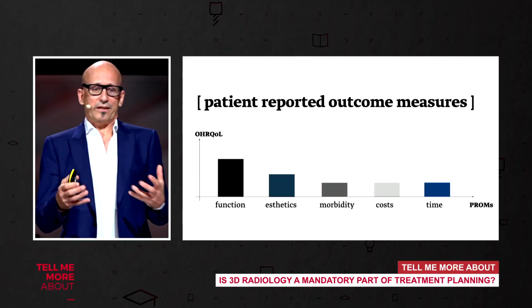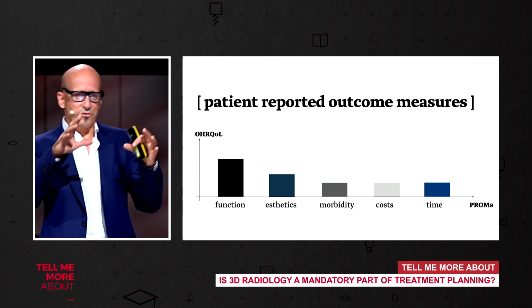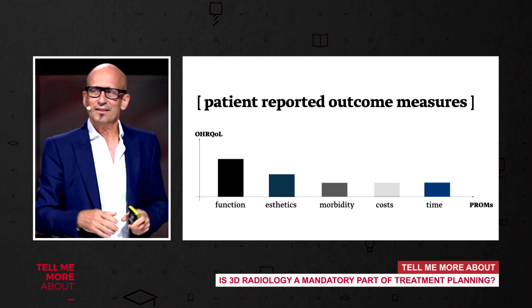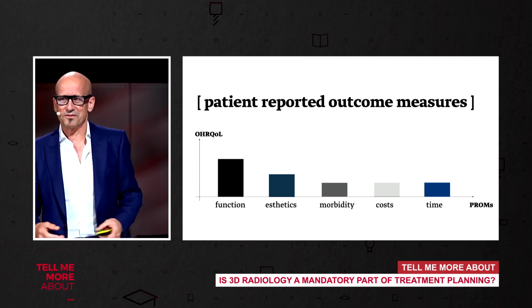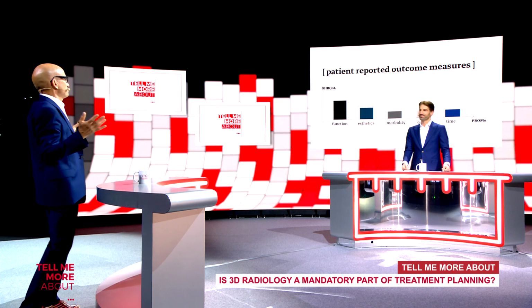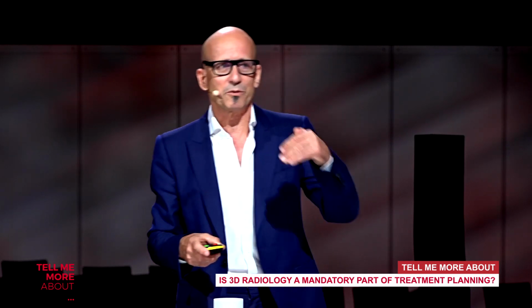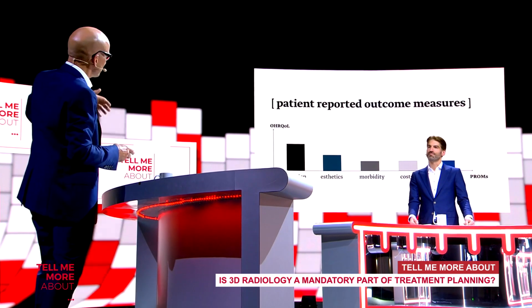So yes, at the beginning, we thought this new technology helps us to place the implant in the right position, which is important, no doubt, in the position three-dimensionally. And we now have this opportunity to get there much closer than when we do it free-handed. But a very experienced guy will tell you, come on, I don't need that. I've been placing implants for 30 years, so I don't need a template or a dynamic navigation with 3D analysis. This is not important for me. Maybe yes, in this indication. But with the introduction I gave you, there is now technology we can use to treat patients in a way that we can fulfill their requests more.